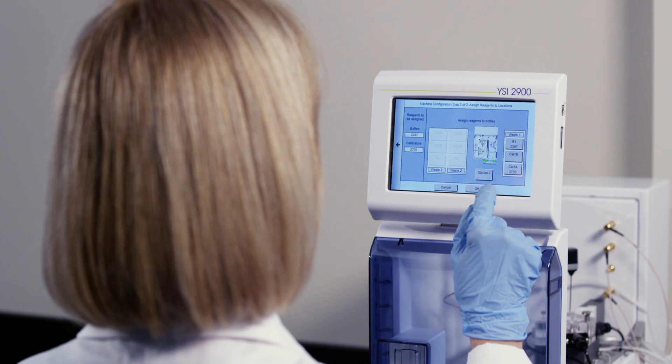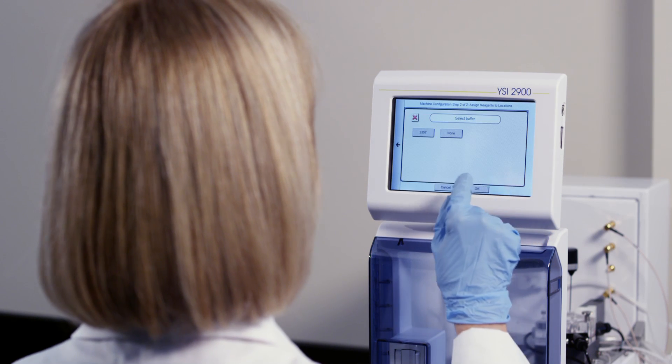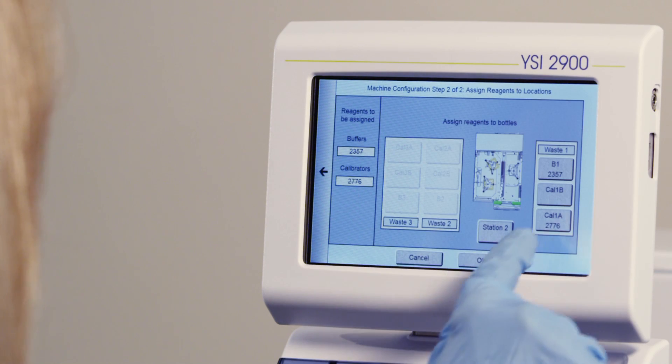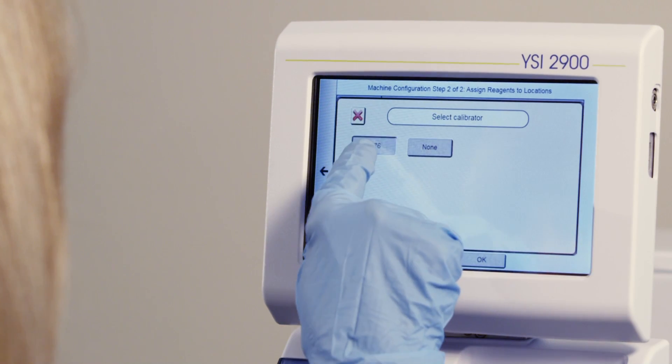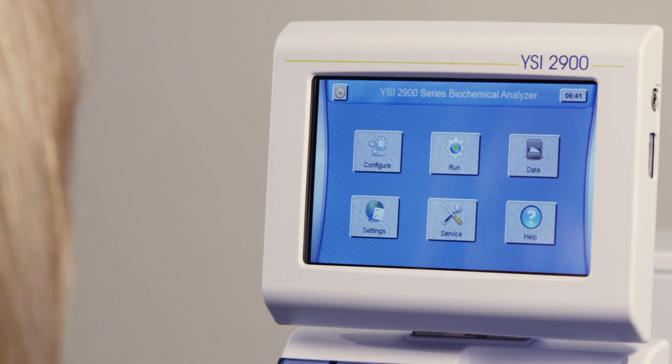Next, press the arrow at the right-hand side of the screen to assign reagents to bottles. Select each bottle and assign calibrators or buffer. When you are finished, press OK.